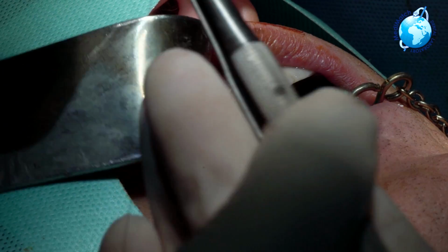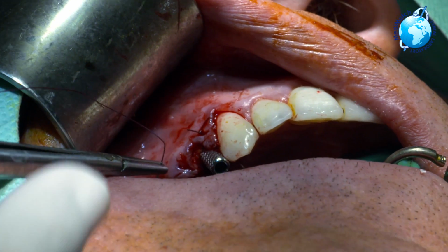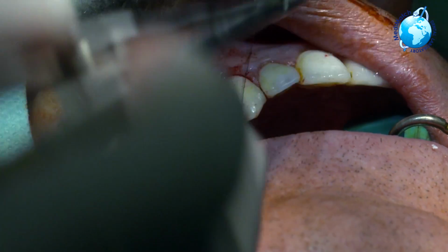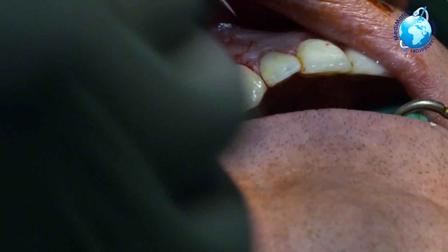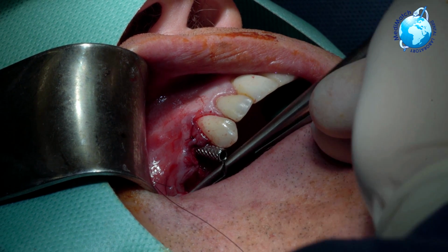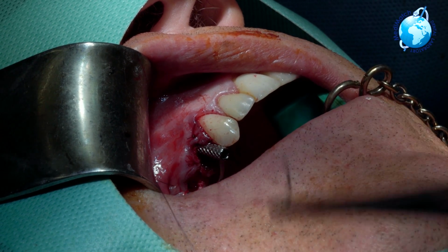So I'm going to go either side of that healing cap, Bianca, as a horizontal H. So we're doing a horizontal H, just one continuous, just to take it around here. And you're going to get me some hemocollagen, please. Yes, Bianca? Hemocollagen.